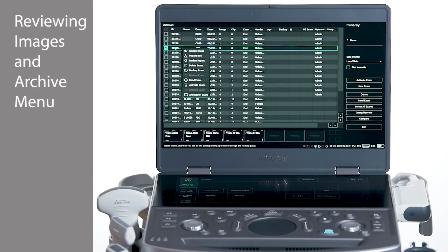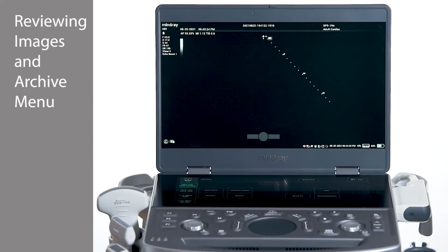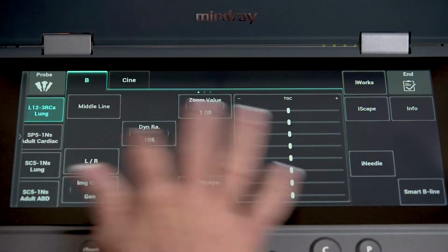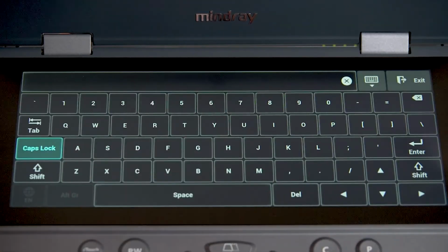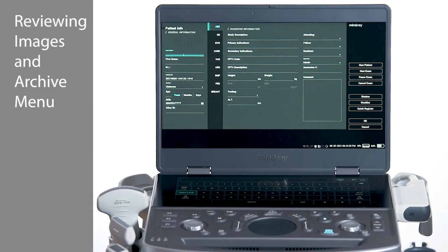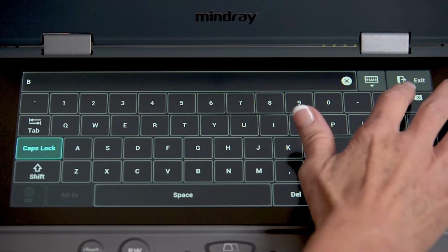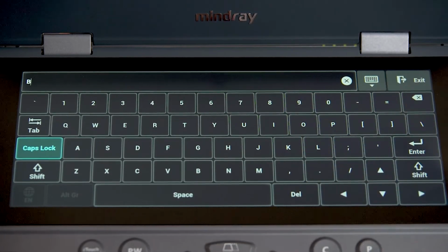To change patient demographics, tap once to highlight the desired patient and choose Activate from the drop-down menu. Navigate to the Info tab on the touch panel to change demographic information. To update, use the cursor to select a field and make necessary changes. Select OK when finished, then End Exam.